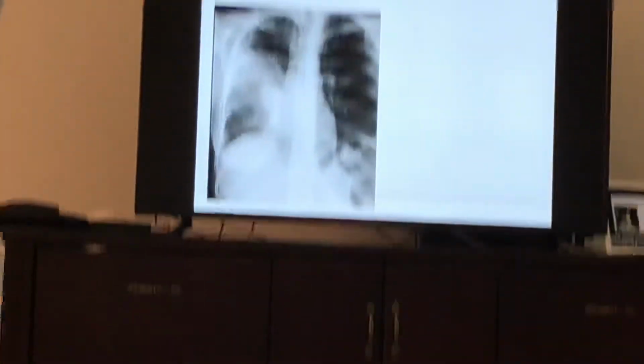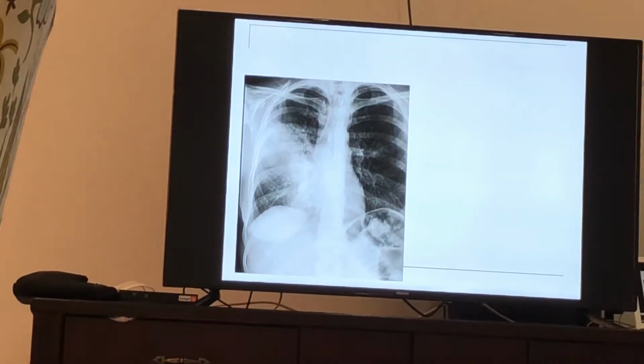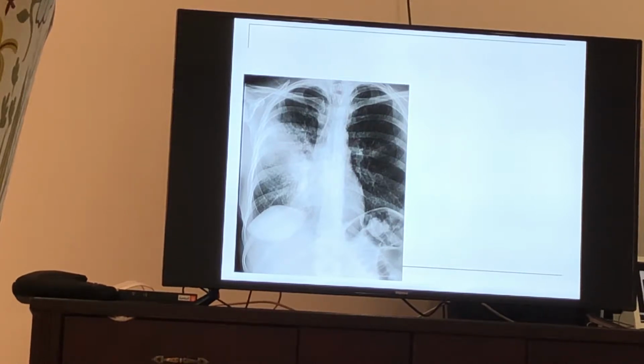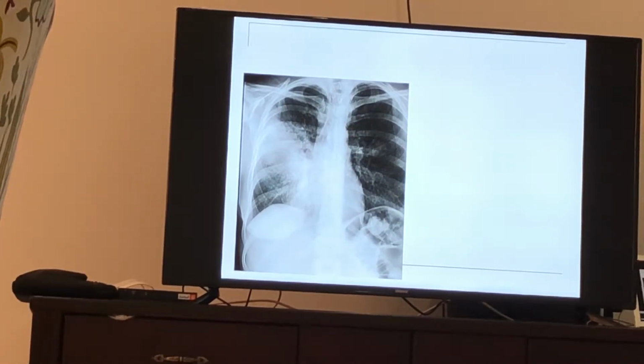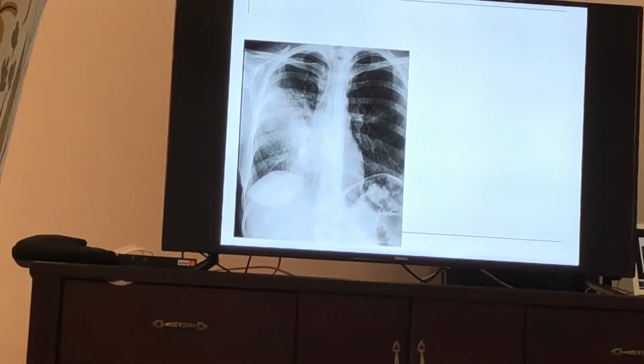Yeah. It's in the mid. Can you localize the right? I'm just trying to tell you there's more. So there is right middle, which represents most likely the right upper lobe. What about the right cardiac border? It's still difficult to visualize, which is most likely related to what? The right middle. So can we have two lobes at the same time? Is it possible? It's possible.